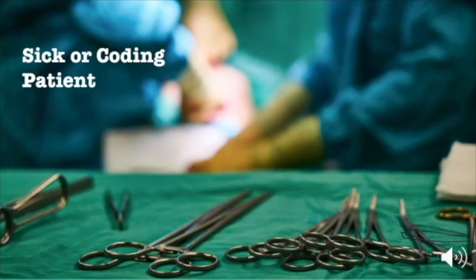However, given this is an LVAD patient, I would really recommend you speak with one of the doctors prior to starting any of these medications. Now keep in mind, it's not uncommon for an LVAD patient to be in an arrhythmia because they have very sick hearts. Also, the scarring from the surgery can make them more likely to be out of rhythm. So if they are indeed stable, do not cardiovert.